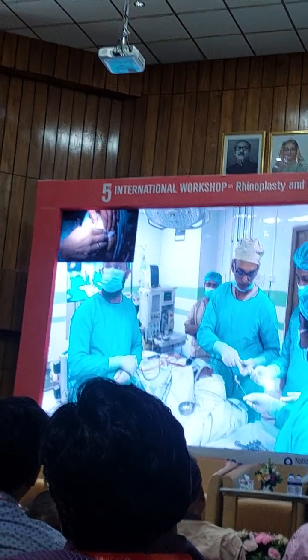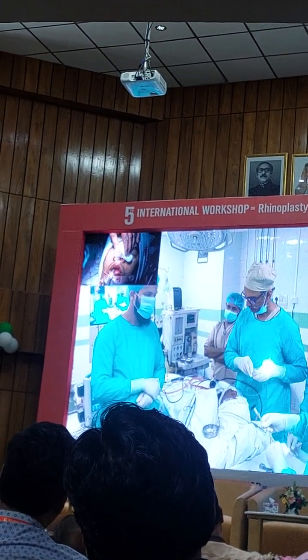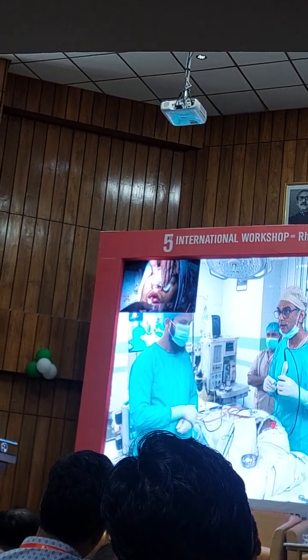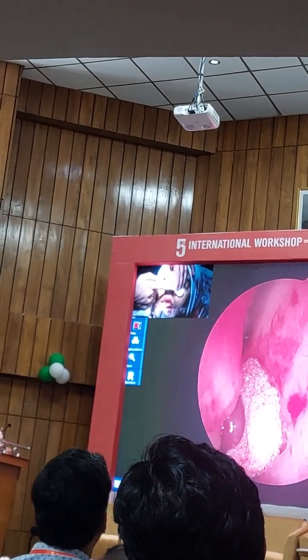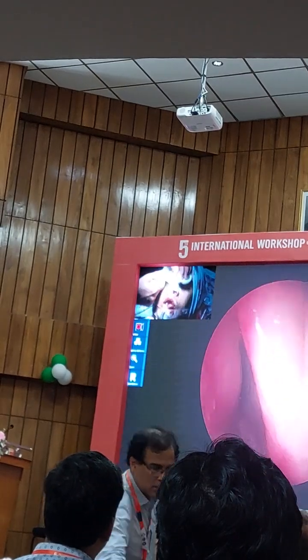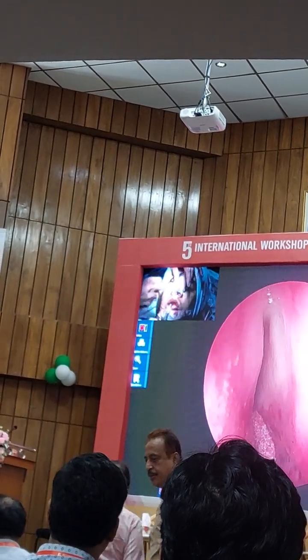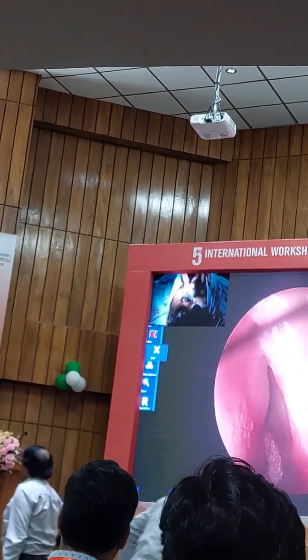Sir, you are approaching your frontal sinus by following the intact bulla technique. At the moment. Now, if I have to use a 70 scope, it may not be possible because I need to create space for my endoscope. Okay, so we will check. If I feel at any point that I'm not able to get a good view, then I will change. I need a bigger image.